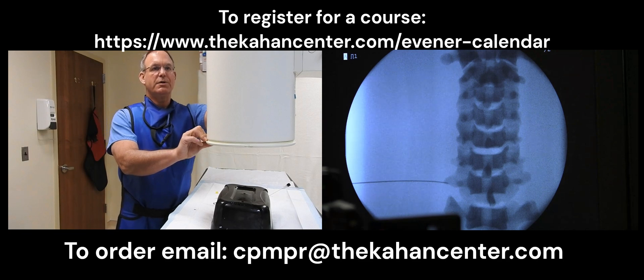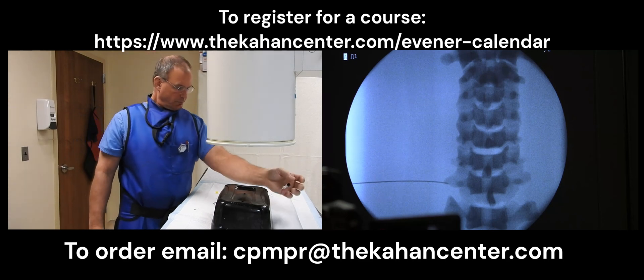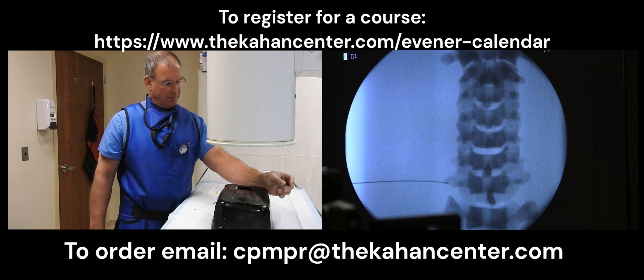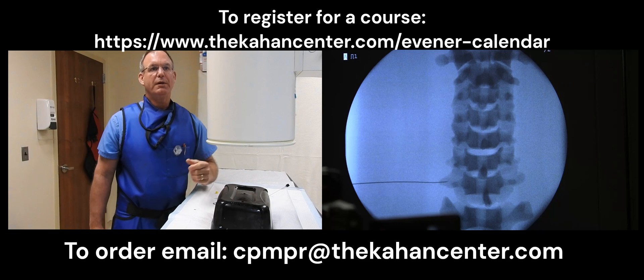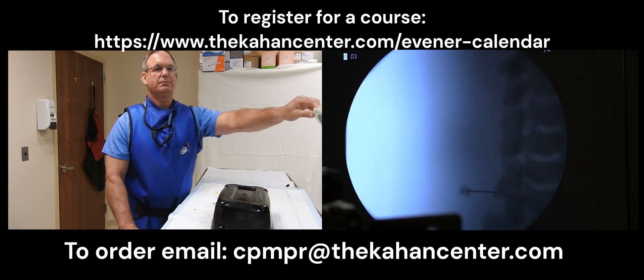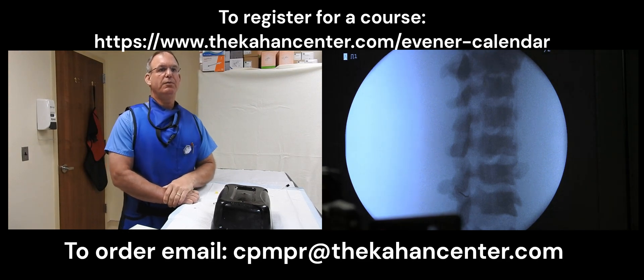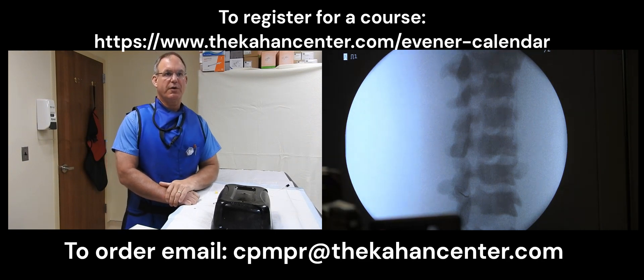Right now we're sitting right outside the neuroforamen. With this view I'll rotate my needle so that it goes slightly more cephalad and advance inside the neuroforamen. At this point I would inject my dye. And as you can see in our oblique view we've remained in the posterior inferior aspect of the neuroforamen. And that will complete your transforaminal injection.